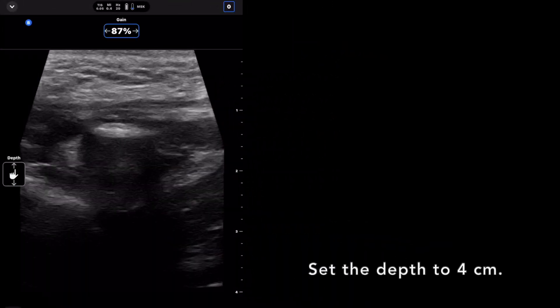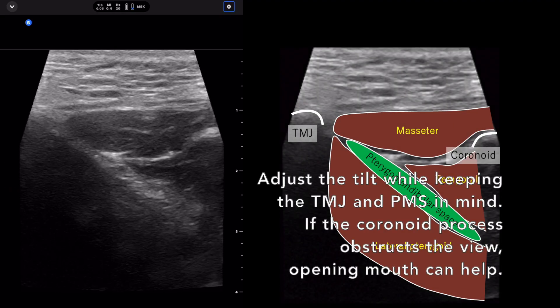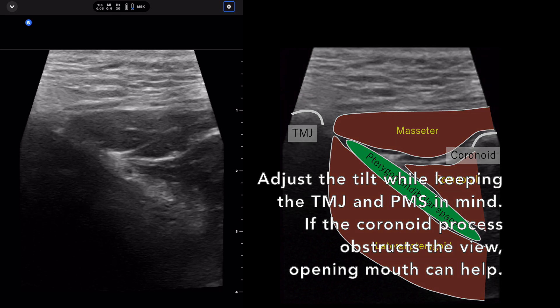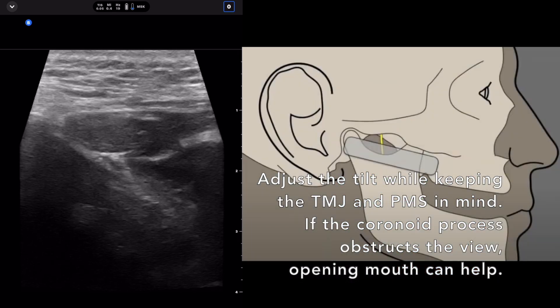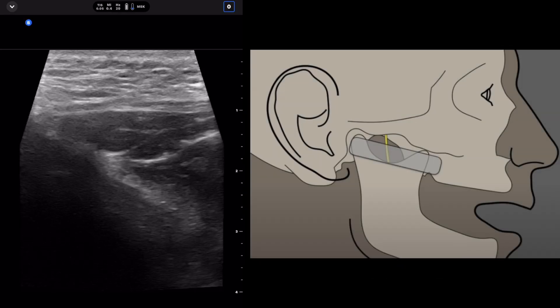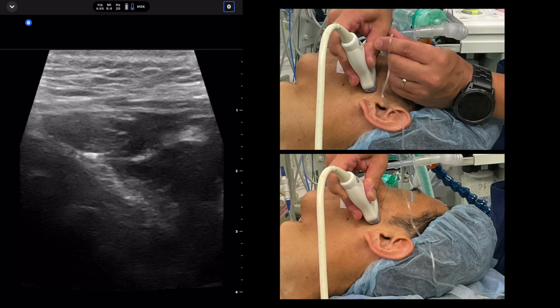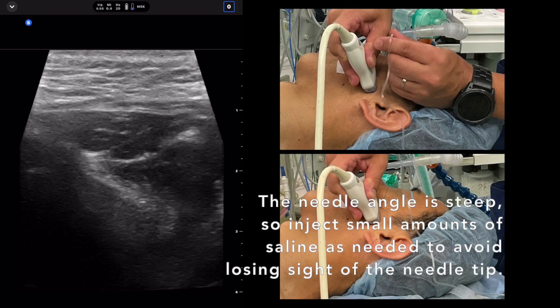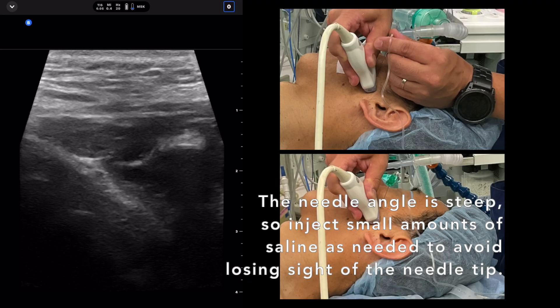Set the depth to four centimeters. Adjust the tilt while keeping the TMJ and pterygomandibular space in mind. If the coronoid process obstructs the view, mouth opening can help. The needle angle is steep, so inject small amounts of saline as needed to avoid losing sight of the needle tip.